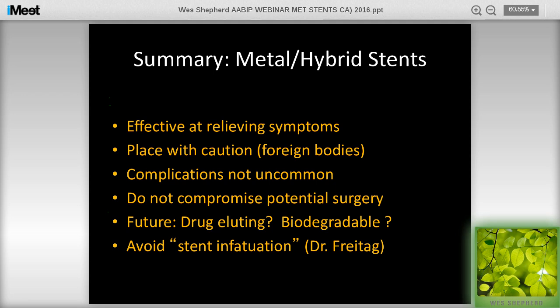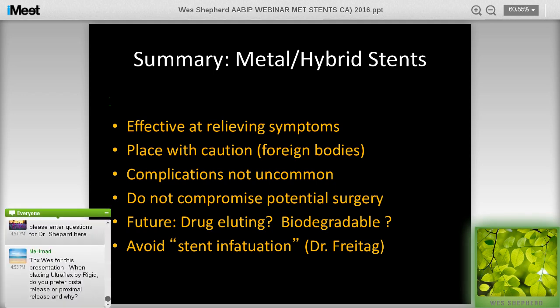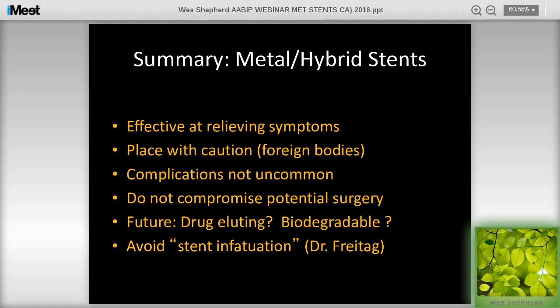Yeah, I think so. And the caveat is, most of the time in placing these stents for malignant airway disease, we're not removing them because the patients typically have limited life expectancy and die with the stent in place. The Aero stents, because they're fully covered, are less likely to granulate and attach, and oftentimes can be easier to remove in these settings.